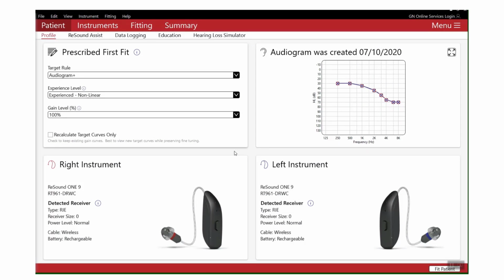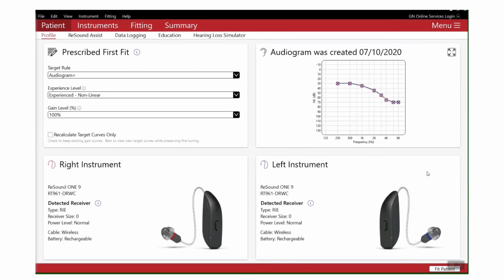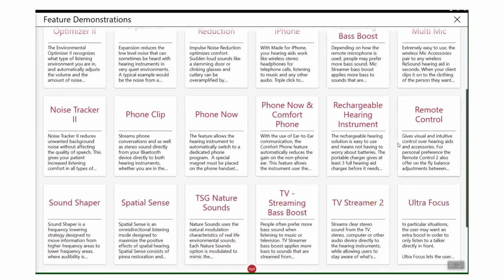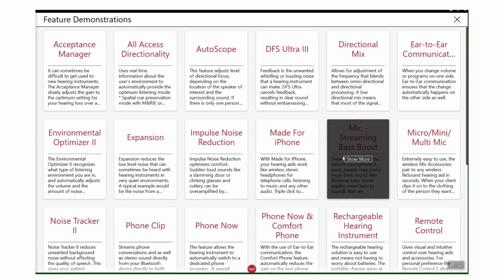Top tip number 1, know your features. Sounds obvious, but with all the training in the world, things can still get forgotten or slip through the net. But don't worry. If you go into menu and down to feature demonstrations, you will find a catalogue of every single feature and a nice brief explanation and also a video to explain what that feature is and what it's going to do for you.